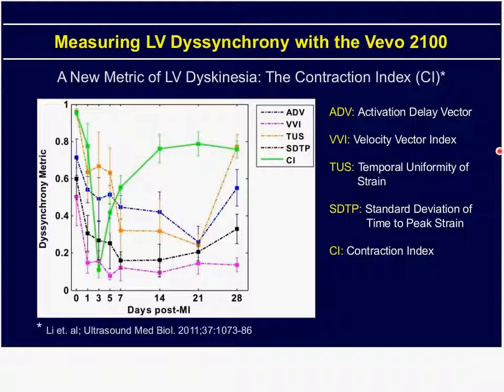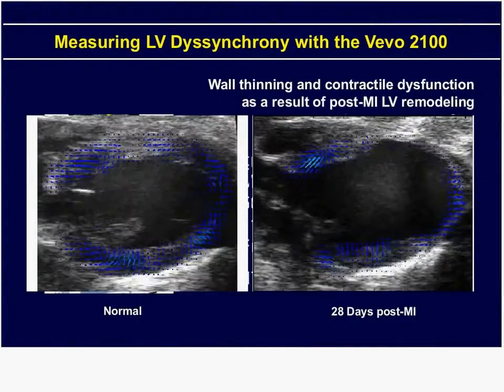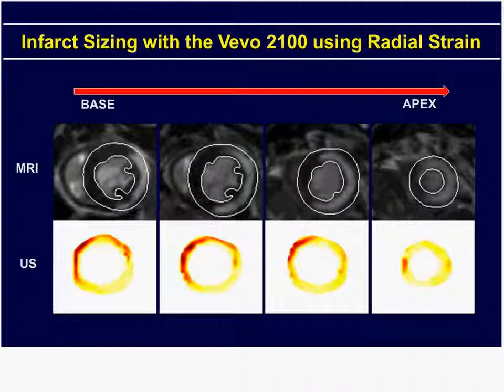Just another question here about infarct size, and whether you looked at that with TTC, also with MRI and ultrasound. So in various studies, we have not yet performed the ultimate study. Previously, in Circulation, we validated the MRI technique against TTC. And in that study, we used the MRI as the gold standard.